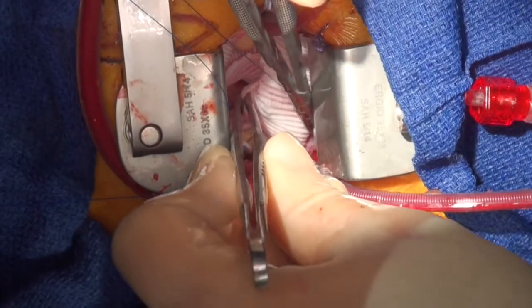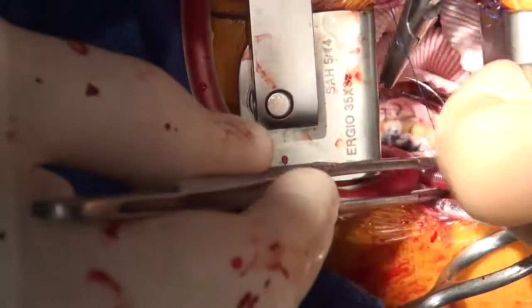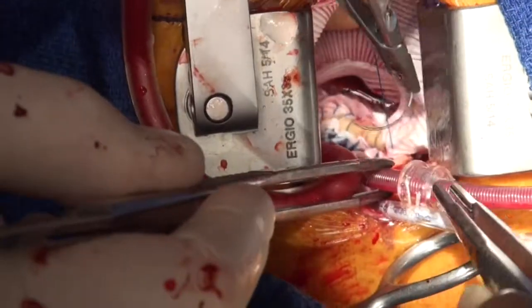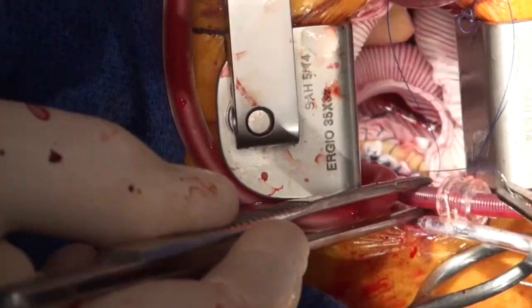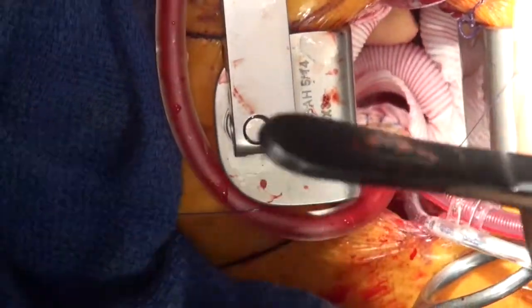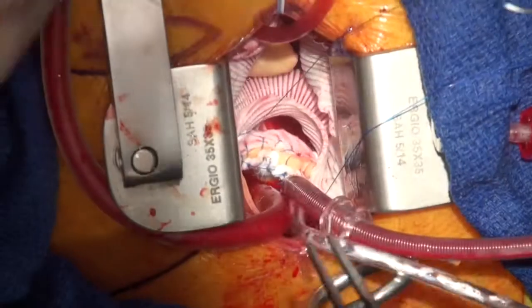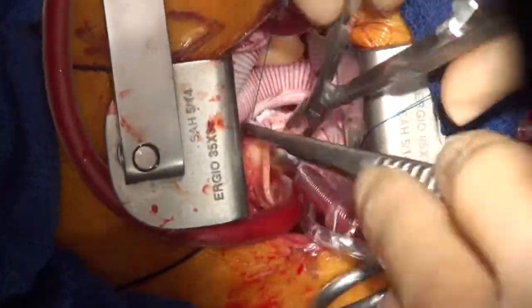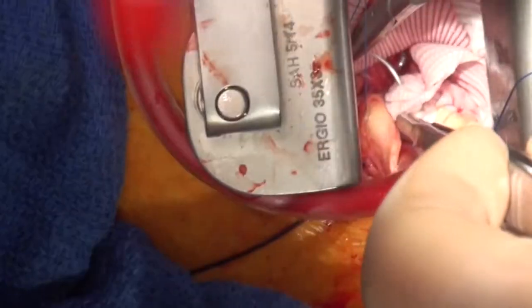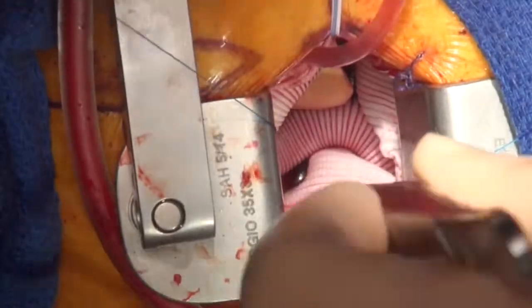He's done all the horizontal mattress sutures and is now continuing the anastomosis. This is 3-0 prolene. For the reinforcing layer he uses 4-0, and when he does the coronary buttons he uses 5-0. We've now gone across to the left-hand side performing the continuous suture, coming clockwise on the aorta to finish at the very top.